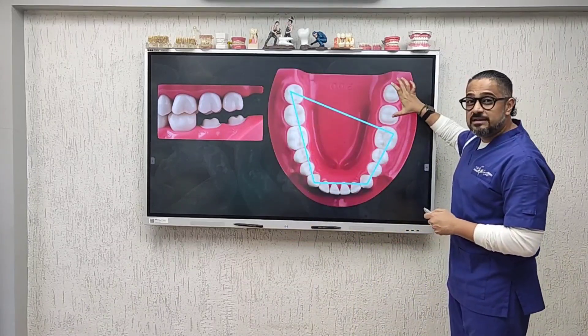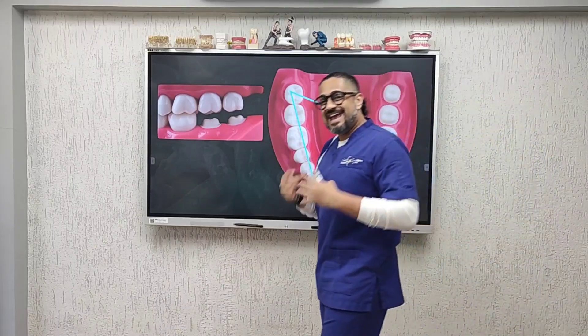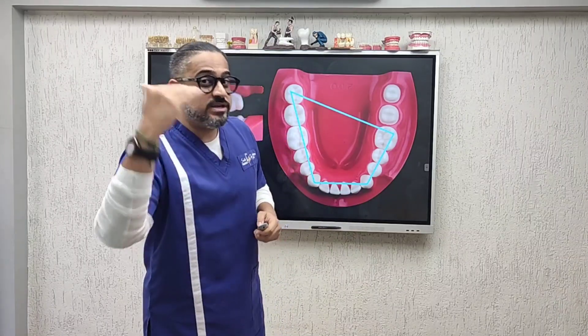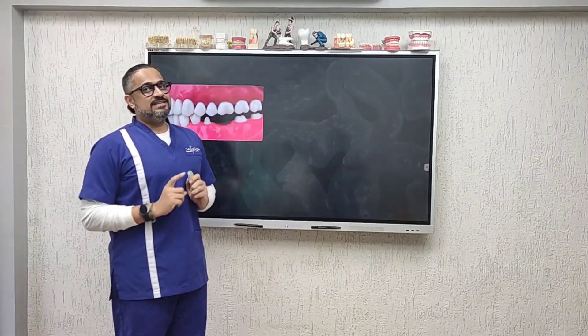Having said that, this is a classic indication where a bite would be needed. In such a scenario, the terminal contacts are missing, which is the reason why a bite helps the technician get the mounting correct and get the final occlusion correct as well.